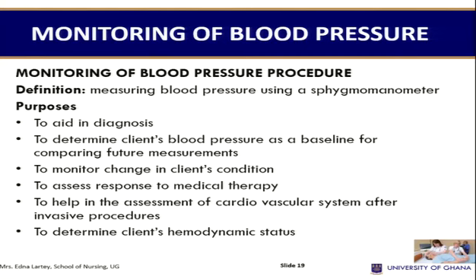So, the purpose for taking blood pressure is, one, to aid diagnosis, and two, to determine the client's blood pressure as a baseline for comparing future measurements, and three, to monitor changes in the client's condition, and four, to assess client response to medical therapy, and also help in the assessment of the cardiovascular system after an invasive procedure, and then finally it helps to determine the client's hemodynamic status.